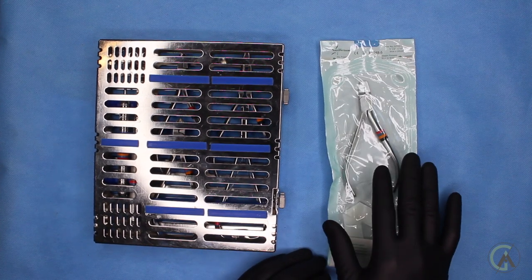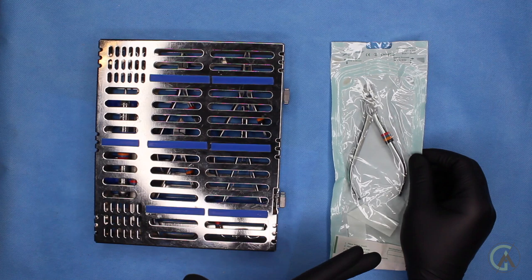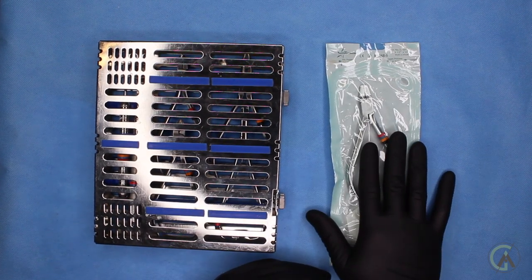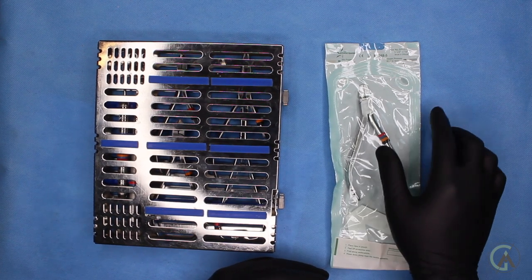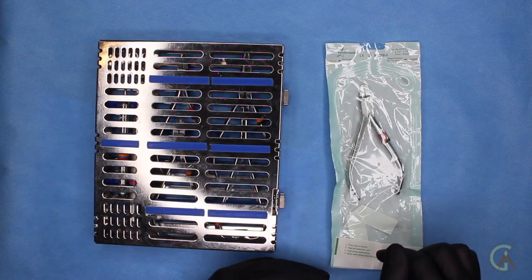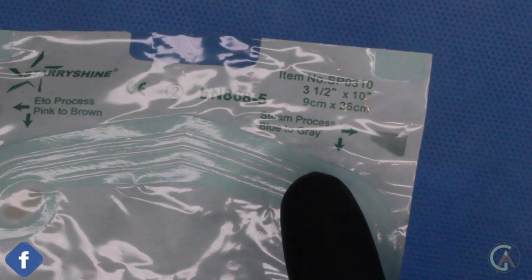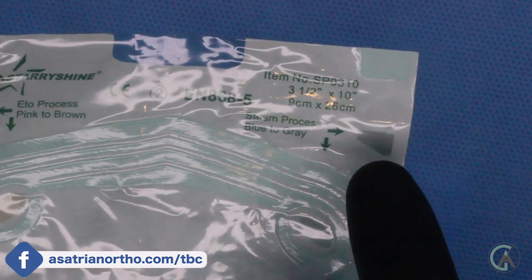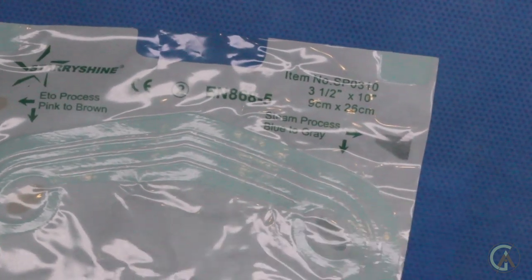And these are autoclave bags — these are the baggies that we use to keep the instruments when we put them into the machine that makes them sterilized. We can check that the bags have been sterilized by looking in the corners where we have indicators. This little indicator here starts off as blue and when it's sterilized, it actually becomes gray — so gray means the contents inside this bag are sterile. These instruments are autoclaved after every single appointment with a patient, and what autoclave means is that they undergo very high heat to kill off any microbiomes on them, including viruses and bacteria.